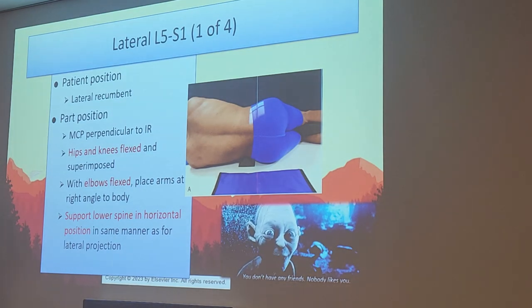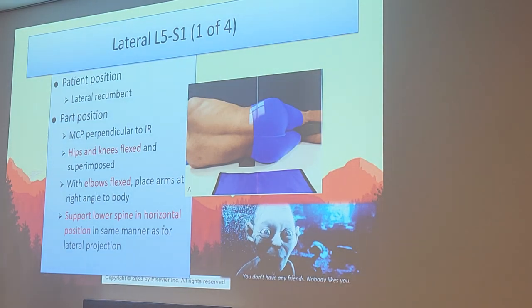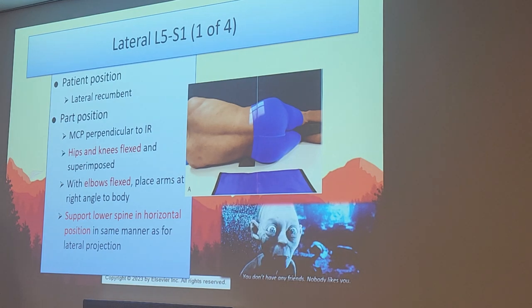Yes. Okay. Mr. Fong didn't tell us to always do it caudad though, because sometimes patients' spines will be like this, and then sometimes like this instead. So he said to angle it whatever would be better, I guess. There are some slight variances depending on shape.